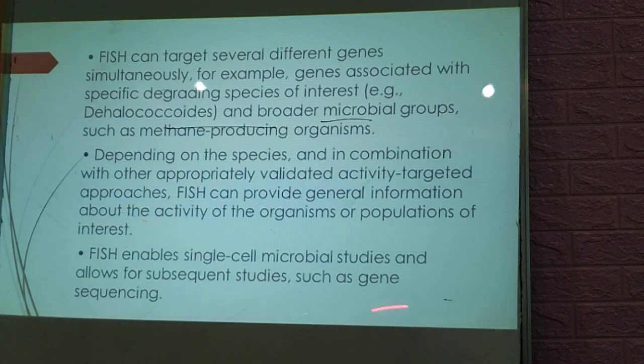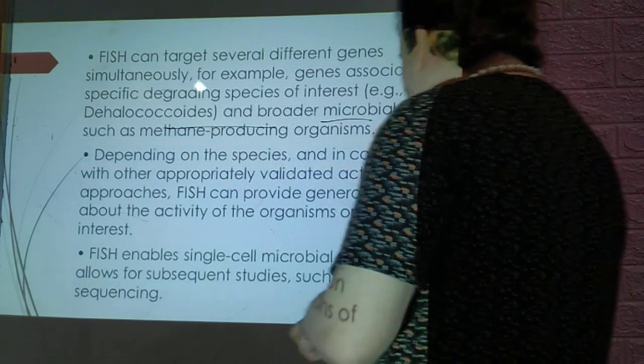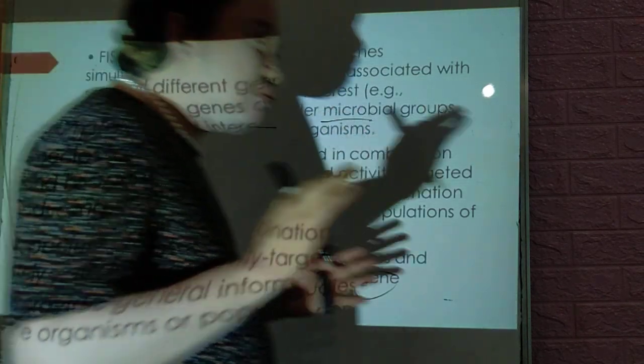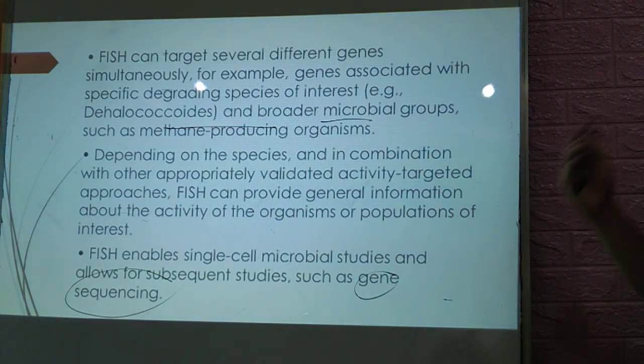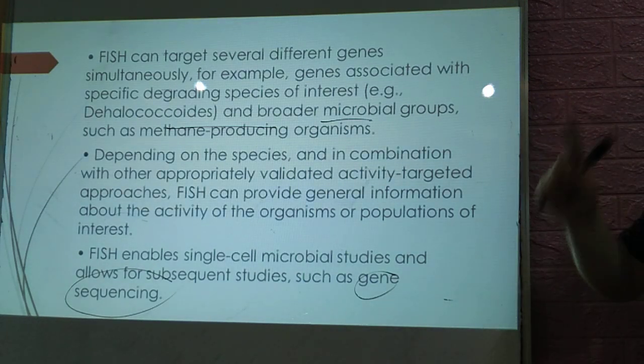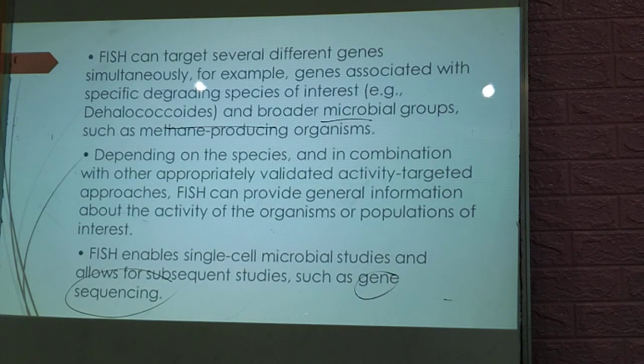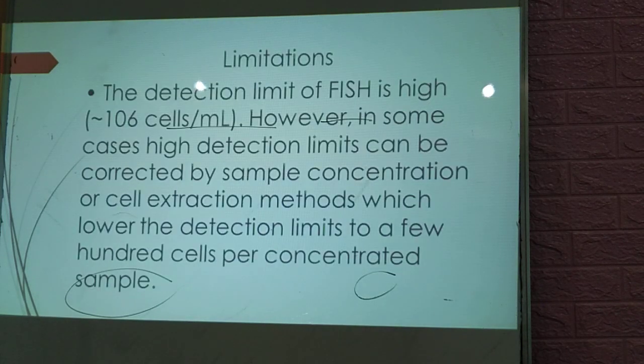FISH enables single-cell microbial studies and allows for subsequent studies such as the one that we will discuss in the future, gene sequencing. You will see that in gene sequencing, it's very important for us to identify the sequence that may be correlated with the disease and the sequence which may be beneficial to us. You will know that as we progress.